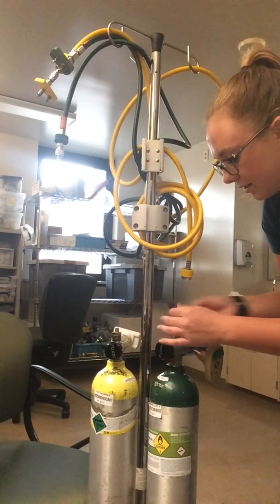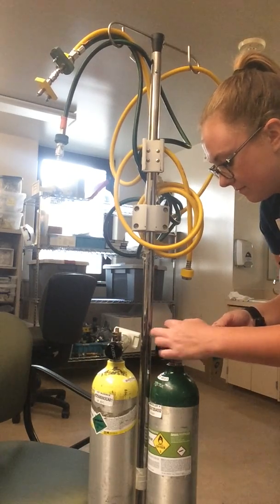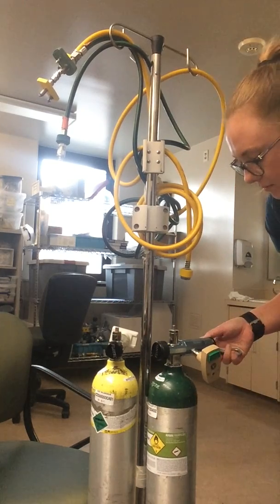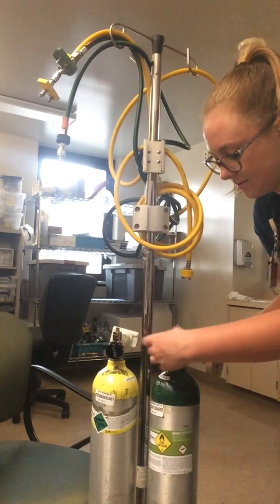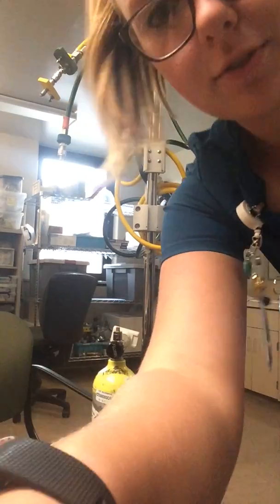Close the tank, bleed the regulator, turn that off, and I can take that off. Thank you so much.